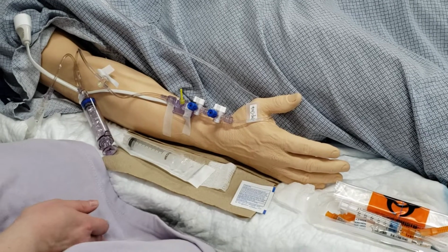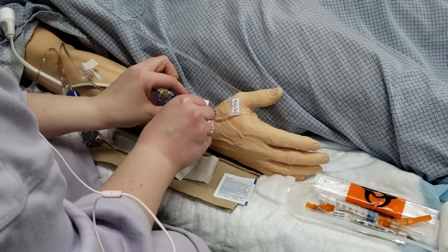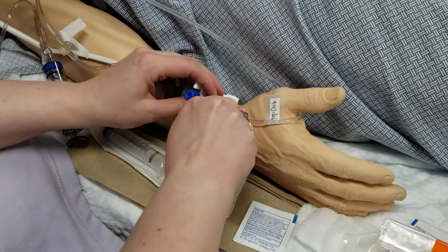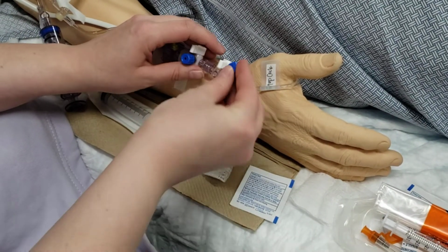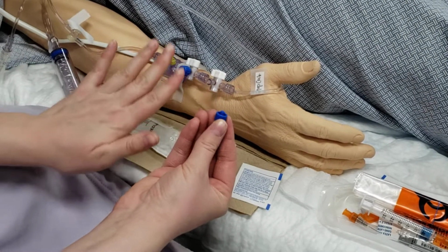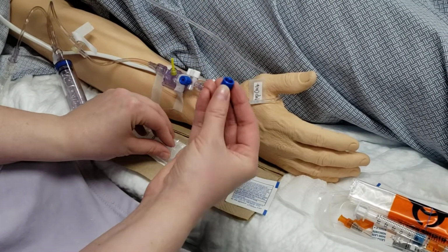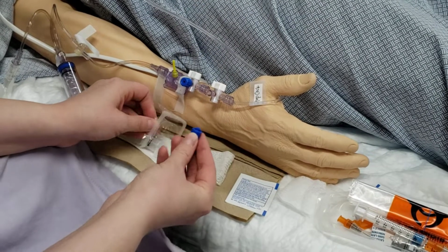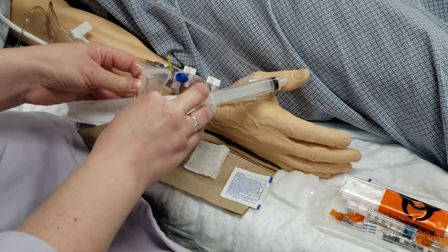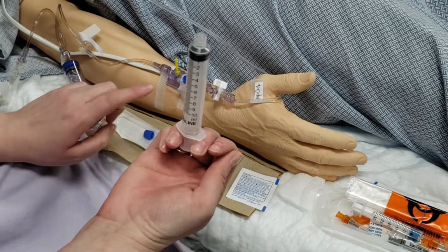So you identify your patient, make sure you're getting the right patient, the right labs, everything like that. You take the cap off the stopcock syringe. And now this is when we need to be considerate that we are opening a line and we are at risk of exposing our patient to an infectious situation. So this cap you can either throw away and replace, or sometimes I'll place it inside my syringe and reuse it because it will be clean in here, either one.